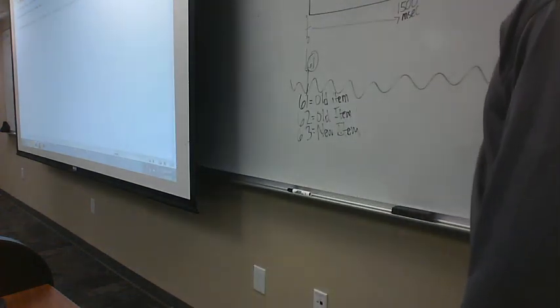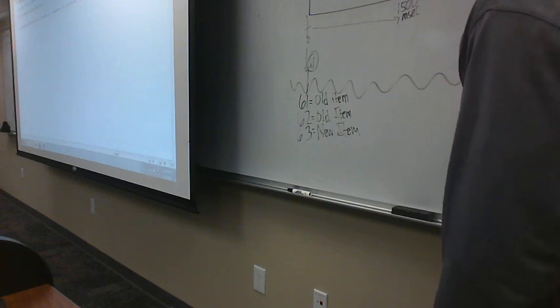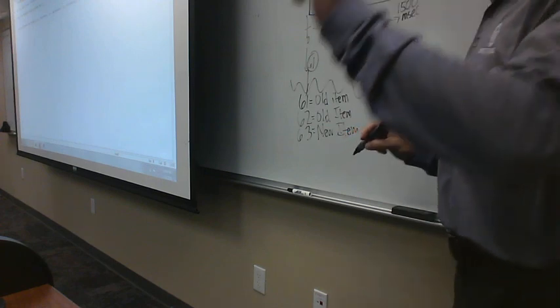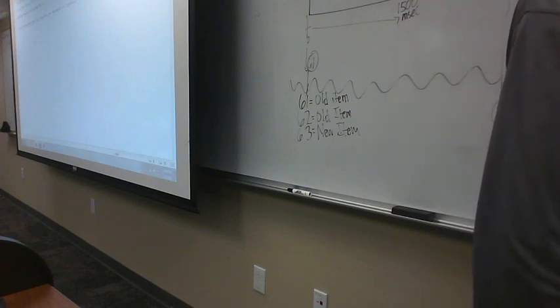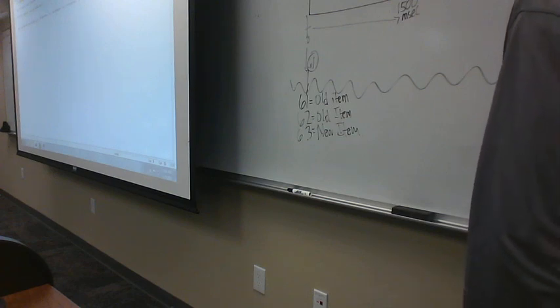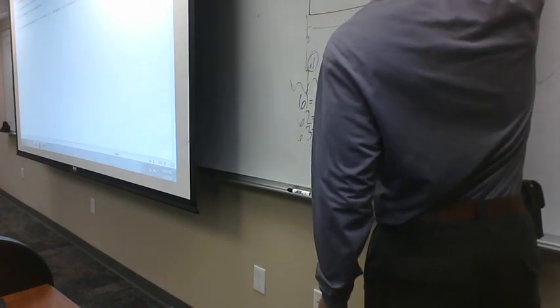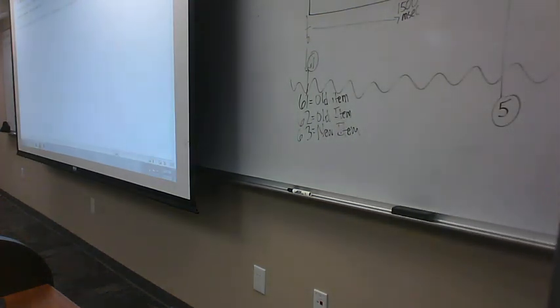Now here, okay, we have when they press, let's say 5, the rating 5 becomes integrated into the EEG. I'll get you in 1 second, okay? But afterwards, there's a second decision we have to ask them to make. The word stays on the screen. The numbers stay on the screen. But now, so we call this your item memory. Okay, because we're asked about this item. Here, we're actually asking them for their source memory next.